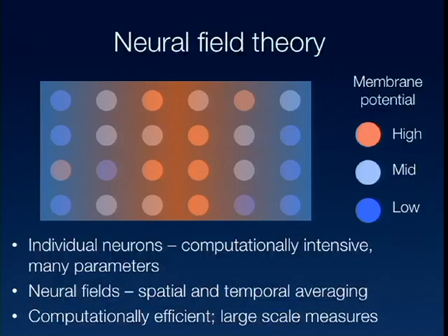But there's another benefit of using neural field models compared to neural mass models, and that is that within a neural field framework we can incorporate spatial variations in the model parameters, which means that further down the line we can start to talk about how we can reproduce differences in EEG power at different positions on the scalp, and in particular for seizures, we can talk about local instabilities and localized seizures and then investigate seizure spreading within this same framework. So the idea is to use this one framework to bring together a whole lot of different phenomena.